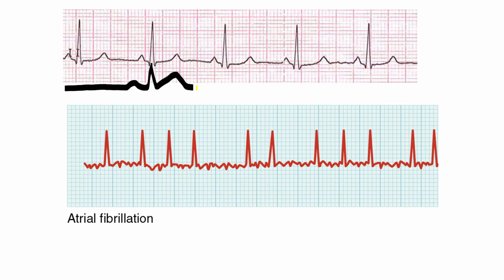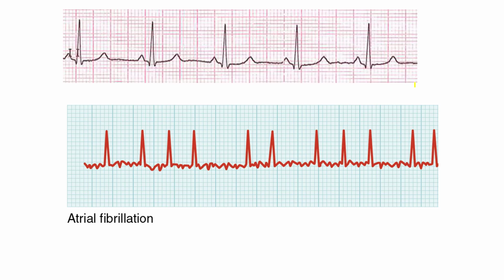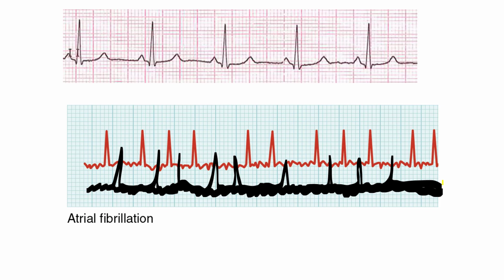What about rhythm, right? So again, we expect in most of our ECGs, especially students in class, to see nice normal rhythm, sinus rhythm: SA node, atria, PQRST. But look at this ECG here. You can see the atria are actually depolarizing randomly, chaotically, and that causes this wavy baseline, almost looks like noise.